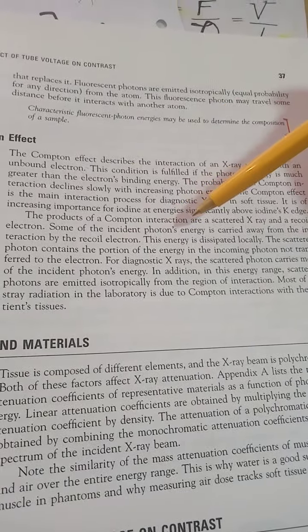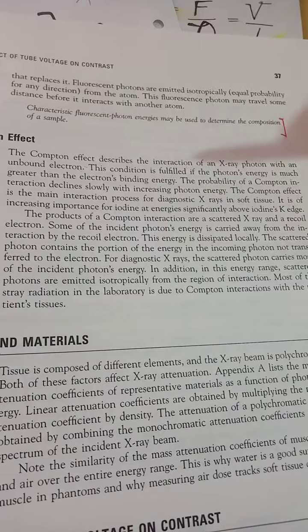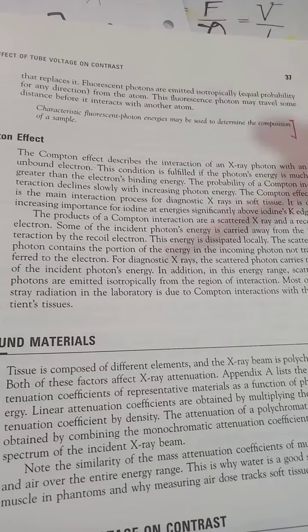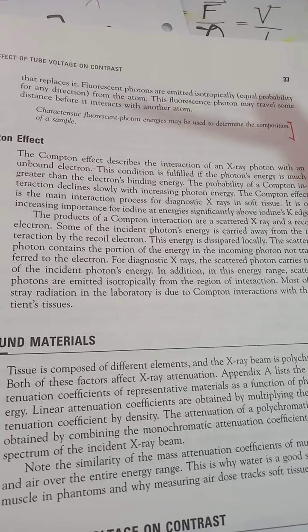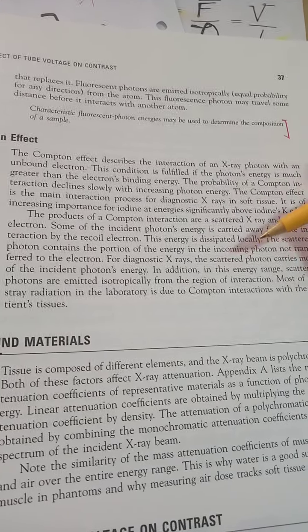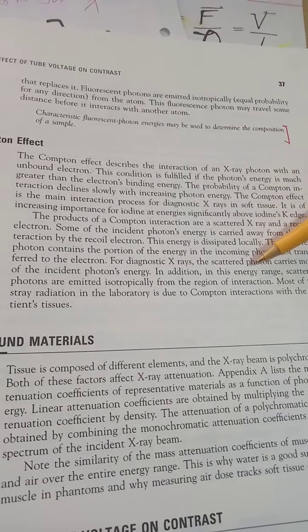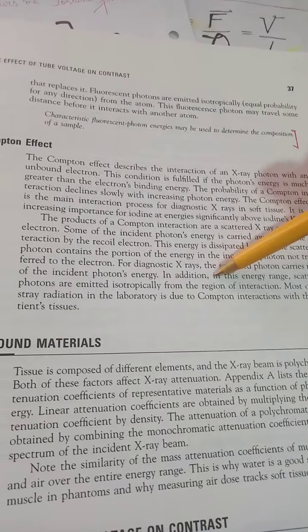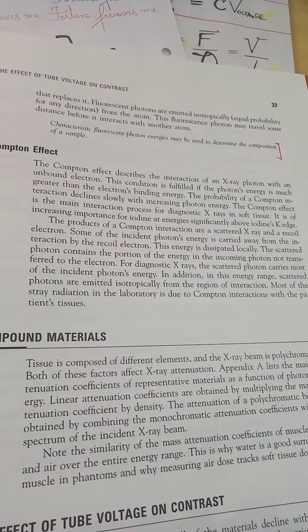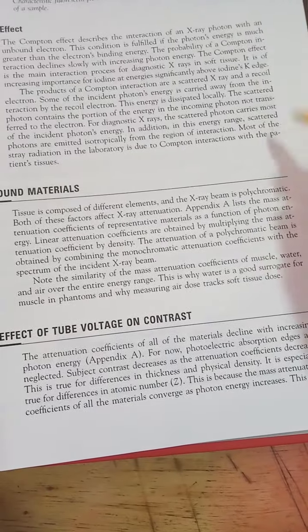Some of the incident photon's energy is carried away and dissipated locally, away from the interaction, by the recoil electron. The scattered photon contains the portion of the energy in the incoming photon not transferred to the electron. For diagnostic purposes, the scattered photon carries most of the incident photon's energy. In addition to this energy range, scattered photons are emitted isotropically, just mentioned here, due to Compton interactions with patients' tissues.